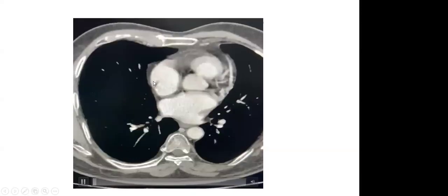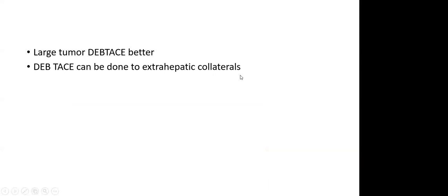So DEB-TACE can be done to extrahepatic collaterals, but be vigilant for complications, especially when you do the phrenic artery. And in large tumors, we experienced that DEB-TACE has better drug delivery as compared to lipiodol TACE.